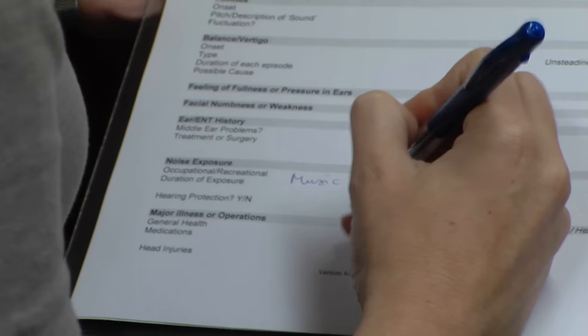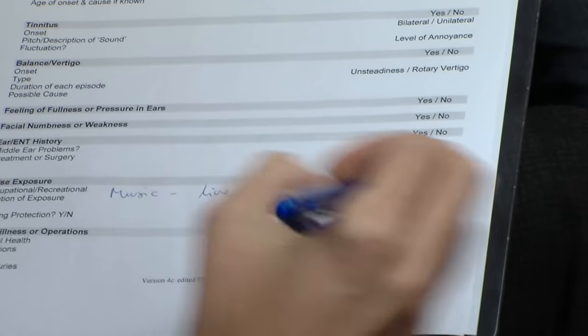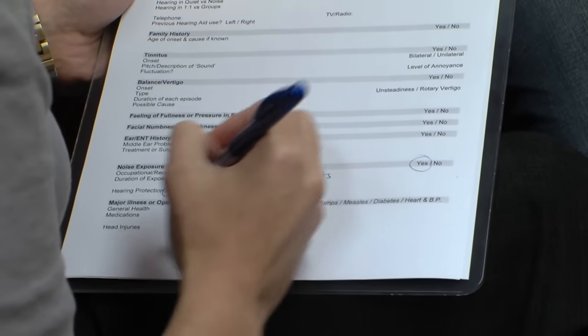And how long has that been going on for? Probably about six months to a year. The history allows the audiologist to elicit information about the patient's main concerns, their hearing and balance history and other relevant medical background information.